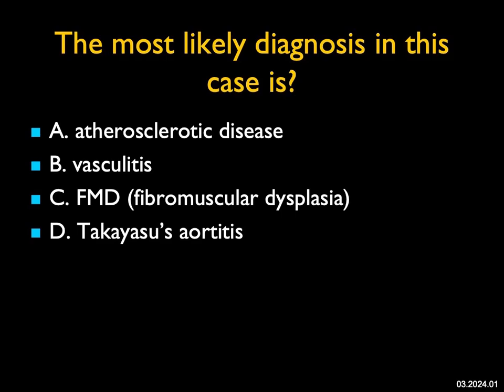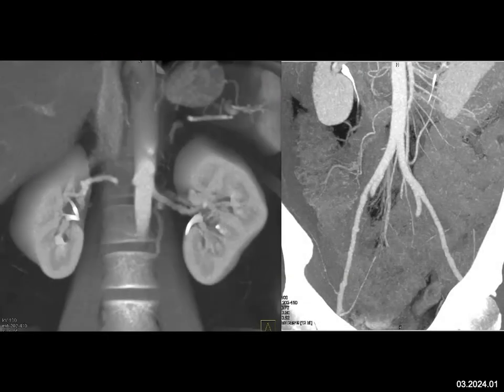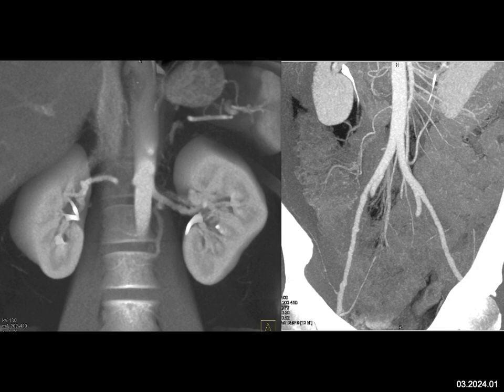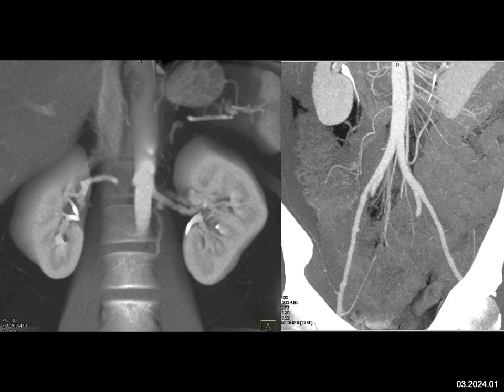The most likely diagnosis in this case: the first thing you see is beading in the right renal artery. That alone would allow me to diagnose fibromuscular dysplasia. You also see beading in the right external iliac artery. It's not the look of atherosclerotic disease — in a sense it is a vasculitis, but it's not Takayasu's aortitis, which is big vessel disease. This is a classic appearance for fibromuscular dysplasia, or FMD.